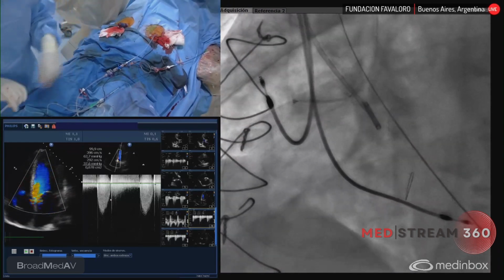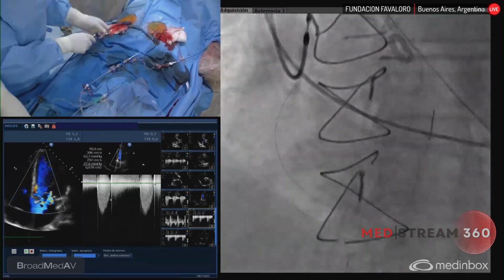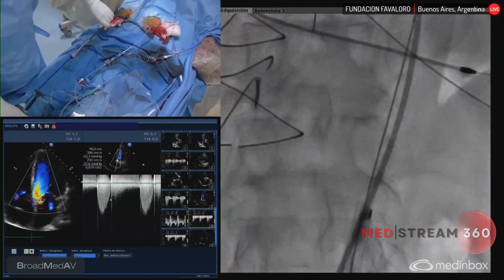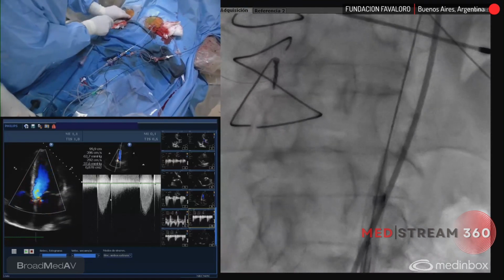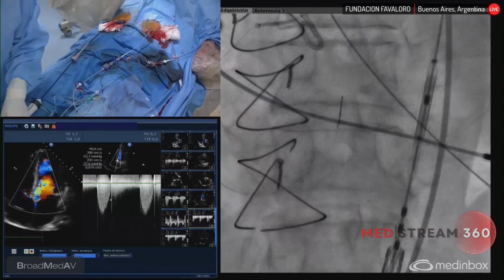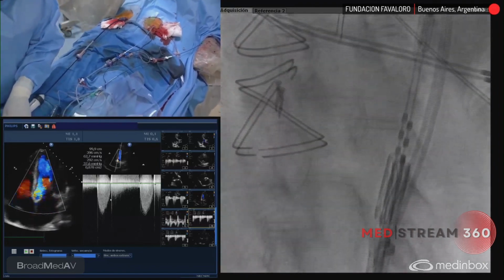I'm going to give a bolus of adrenaline. It should be ready. La punta de la guía y el introductor. Aquí. Dalo. Tené, Carlitos, la guía un segundo. Dale. Okay. So I'm going to open. Empujame la guía. Mostrame el balón. Más abajo, más abajo. Ahí, ok.